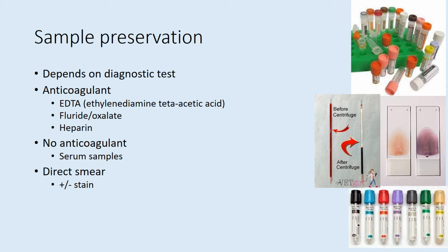We can produce a blood smear from an EDTA sample, but we can also produce it directly from the syringe blood sample. So you can see the picture in the middle here of a blood smear, one with a stain, which is the one on the very right, and one without a stain. If you're taking a sample, producing a blood smear, and then sending it to an external lab, it's not necessarily going to have a blood stain already applied. If you're looking at it in-house to do cell counts, for example differential cell counts, it would be stained, and therefore it's common practice to have a staining solution in practice as well.